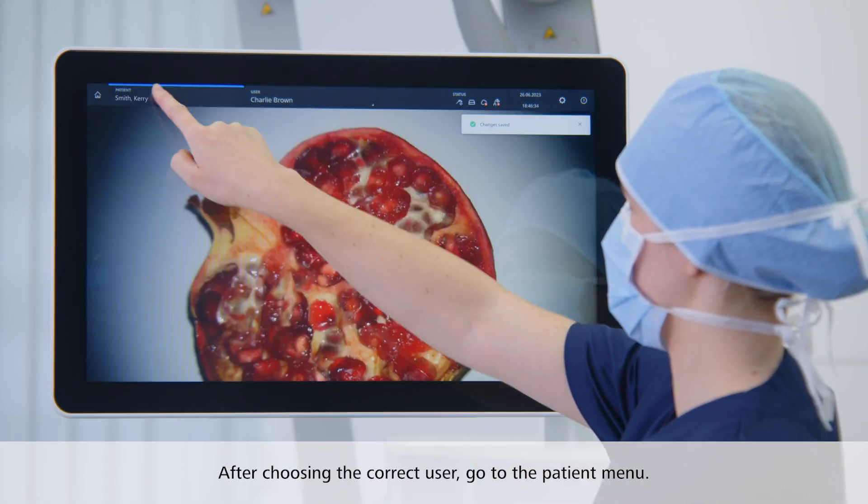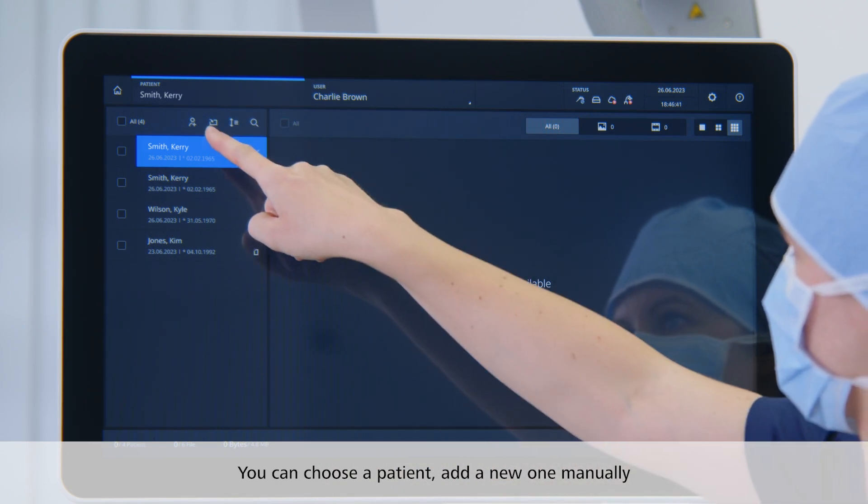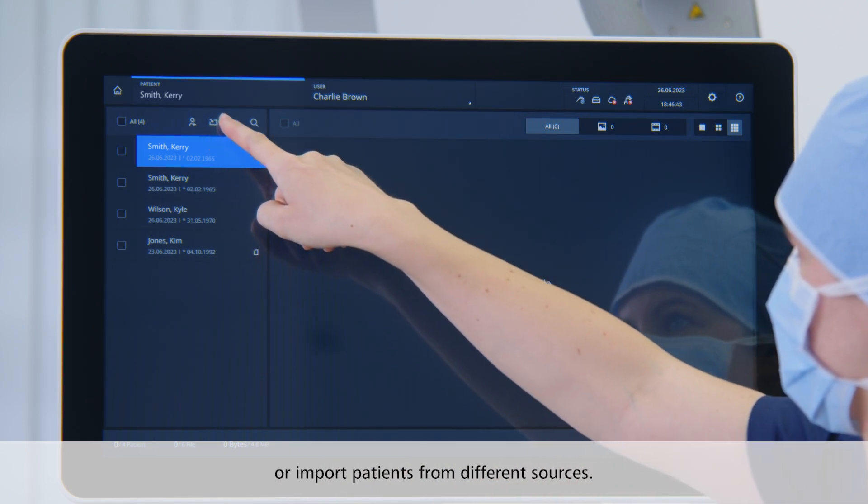After choosing the correct user, go to the patient menu. Here you can choose a patient, add a new one manually, or import patients from different sources.